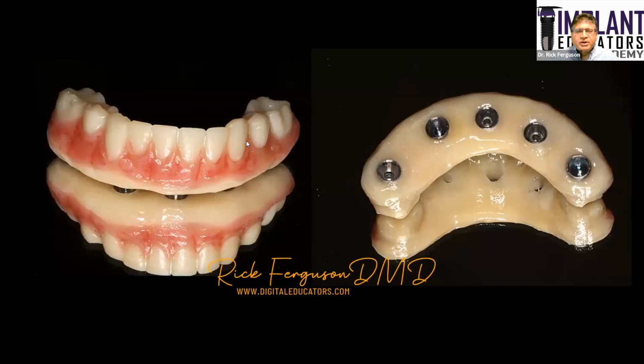This is the finished product. This takes my assistant anywhere from 20 to 40 minutes to do by adding pink composite. And we've been trying the stains from Taub Dental, which allow this process to go a little bit faster.